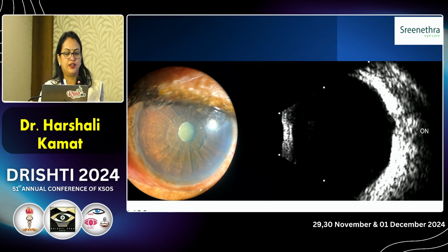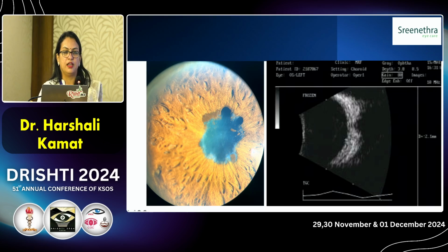In patients who have raised IOP, a non-dilating pupil and dense cataract, a B-scan may demonstrate optic nerve head cupping. If there is a posterior complicated cataract with posterior synechiae and non-dilating pupil, you may use ultrasound to detect choroidal thickening, and that would delay the timing of the cataract surgery.